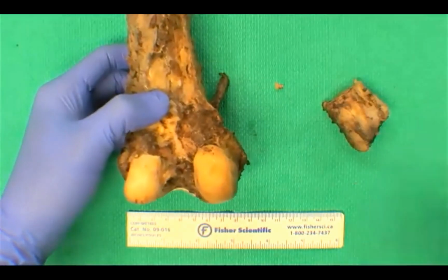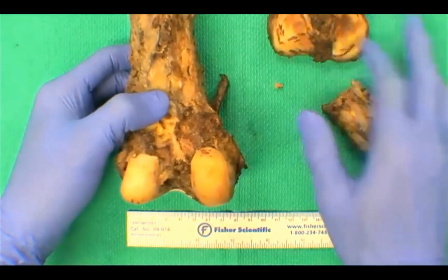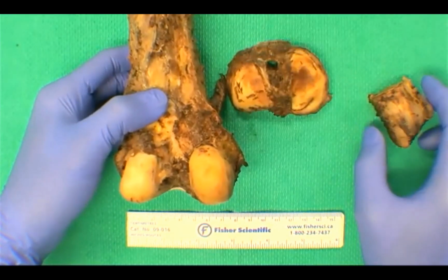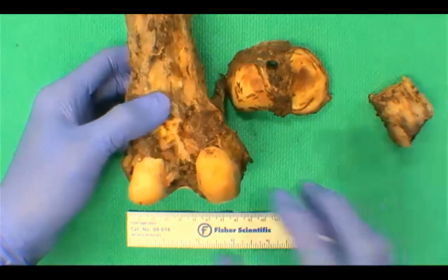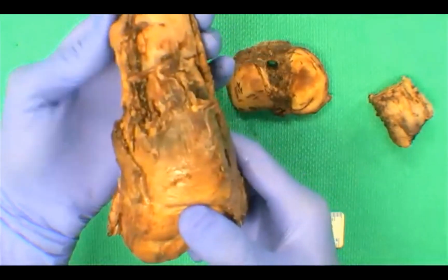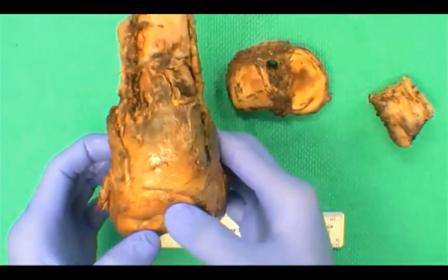Okay, so what bone do we have here? Distal femur, because the other part I didn't show you, we have a portion of the tibial plateau here as well. Sorry about that, I'm just reading the screen as I'm talking. All right, let's go back here. So yes, this is a segmental resection of the distal femur.